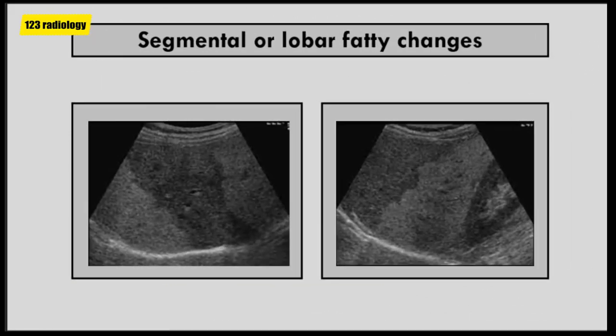Most cases of fatty liver changes are of the diffuse type. However, segmental and lobar distribution has been reported, as you can see in these two cases.